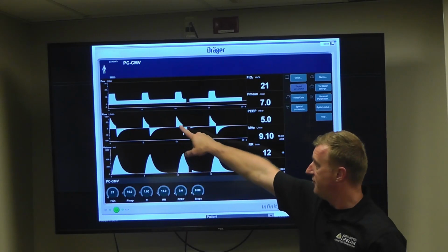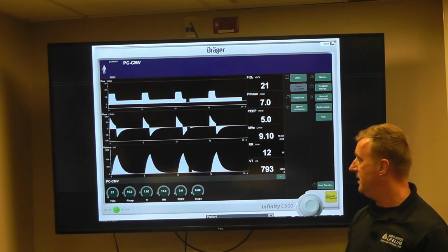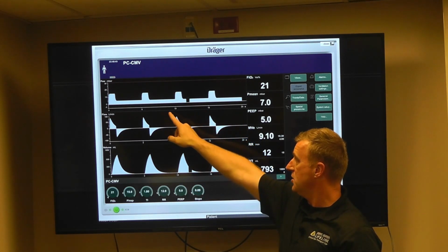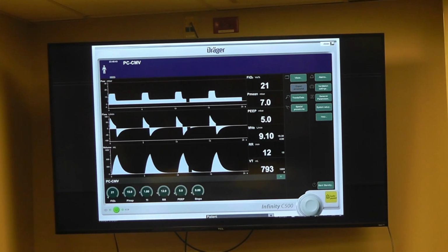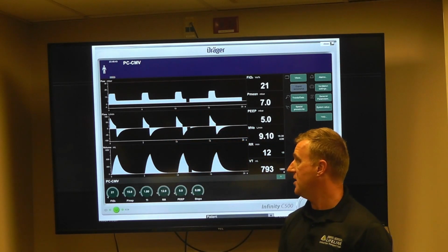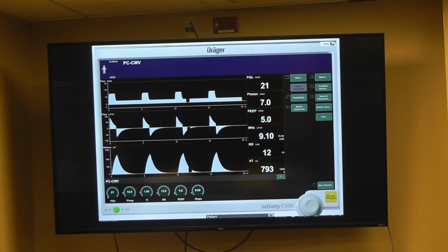Our flow is front loaded. So in this case, the flow turns on at, let's call that 75 or 80 liters a minute. So flow 80 liters a minute until we hit our pressure goal, and then it does what's called decelerating off. It's a decelerated waveform, so it looks like the backside of a really steep ski slope, right? So our flow tails off to maintain that pressure. And then we open our exhalation valve and we get negative flow, so flow below that flow waveform, okay? So our flow is front-loaded. We turn flow on as wide as we can until we hit our pressure, and then we shut it off.